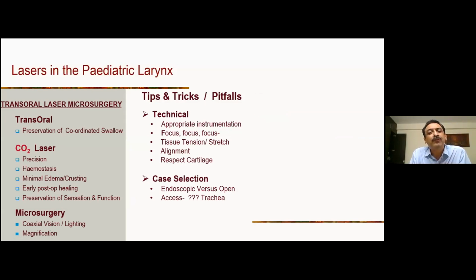The deeper you go, the more likely you are to get out of alignment with the exact line of where you need to work and the line of the airway. And so be more careful as you go deeper. And certainly vascular lesions, it's not that the laser is not good for coagulation, but there's certainly far better equipment now available for coagulation. And I would generally feel that today with the other technology that is available, probably you need to use other things for this situation.